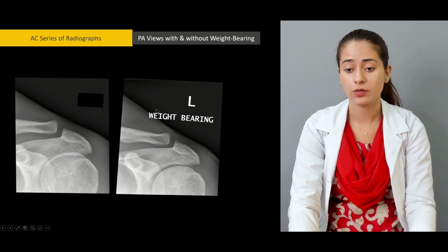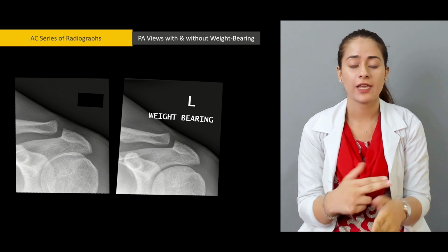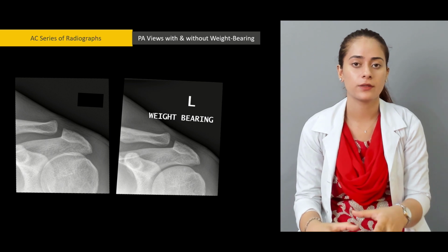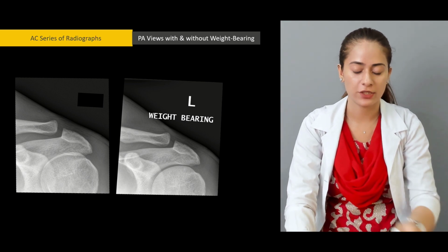So for weight bearing, you should also position the patient. You should adjust everything before handing the weights to the patient, so that that's the last of the entire procedure, so that there is minimum further damage to the joint.